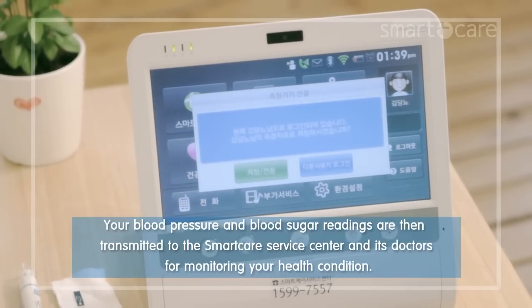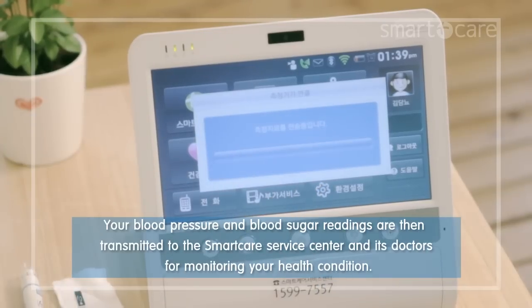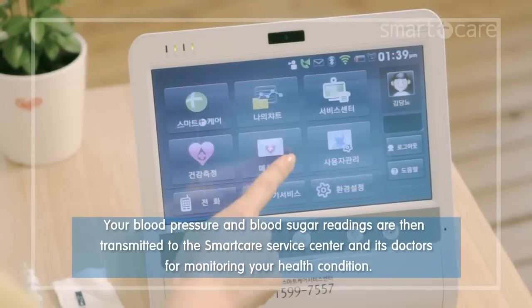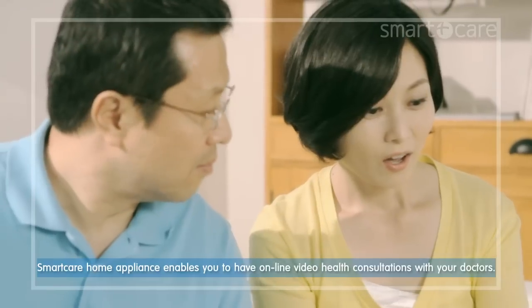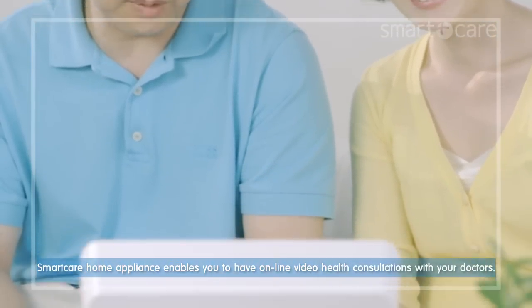Your blood pressure and blood sugar readings are then transmitted to the smart care service center and doctors for monitoring your health condition. Smart care home appliance enables you to have online video health consultations with your doctors.